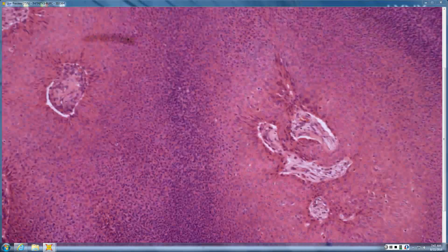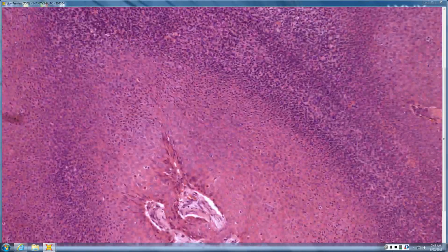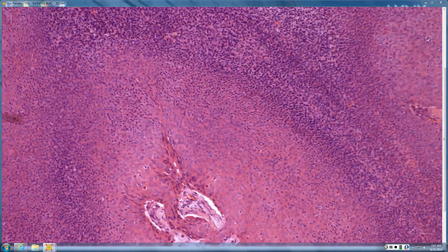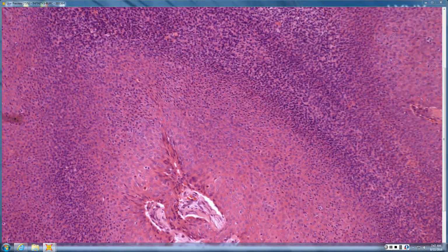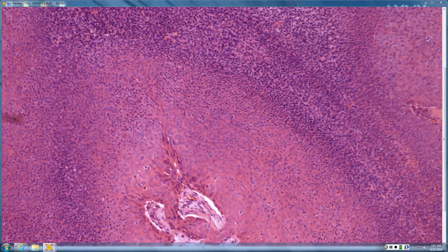And this acrospiroma, is it uniformly pink, or do you have areas that are pink and areas that are densely cellular bluish? Second one. Shockingly, it's the second one. And so that is often a sign of a poroma going bad.